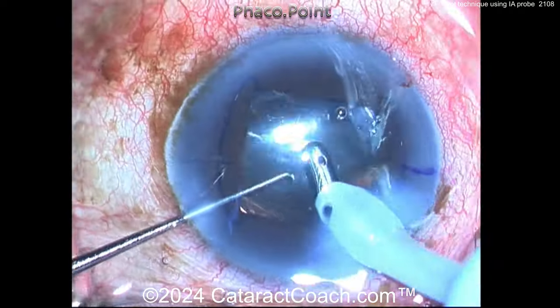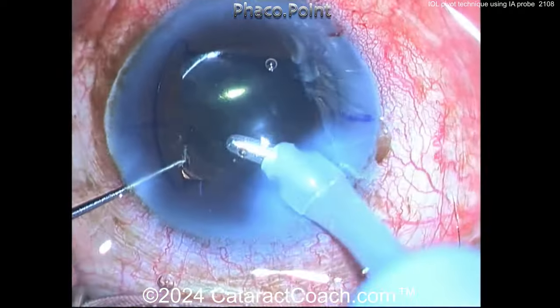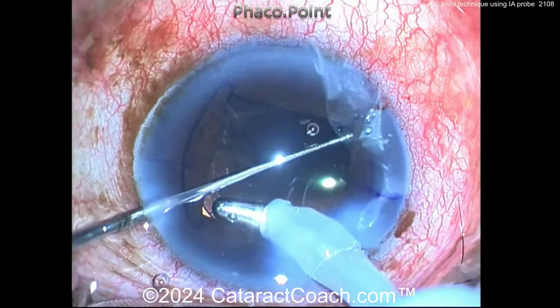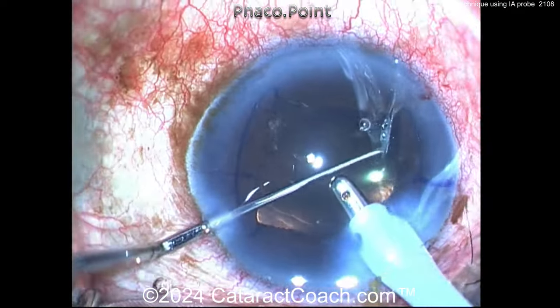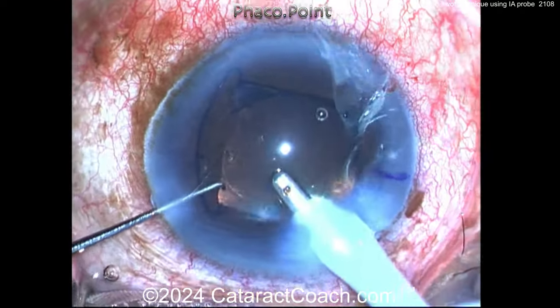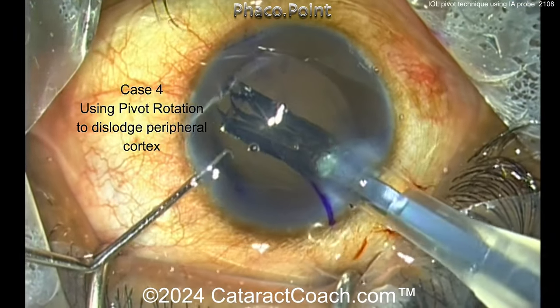Thank you to our surgeon for sharing this technique — it looks like a good idea. Is this something novel for you? Have you ever seen this technique before, or done something similar — putting the probe underneath the optic to infuse under it, lift it up, and get it re-rotated? Here's one more case.